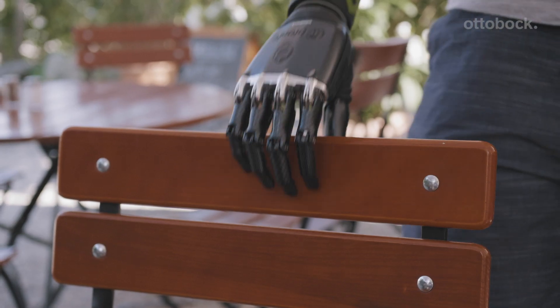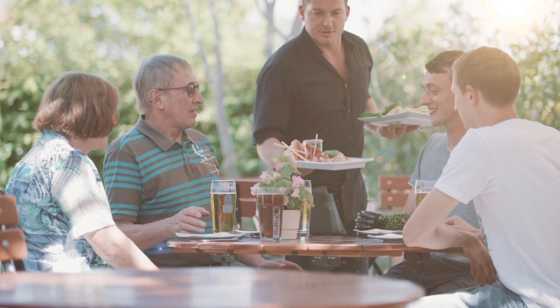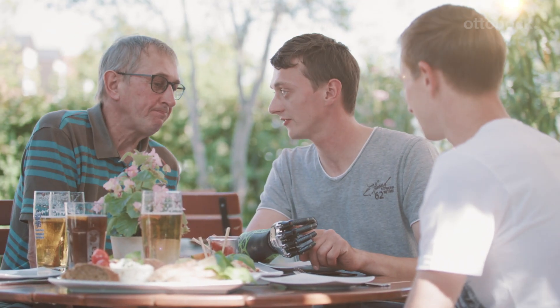It's always difficult at first with the prosthesis. It takes a while to get used to the prosthesis and its proportions and control system. Before my accident I was planning to complete my agricultural training course. I'm now training to be a master in my trade and will take over my parents' farm in the future.